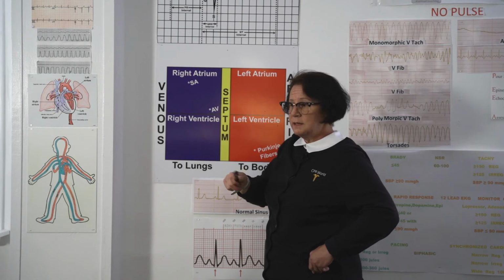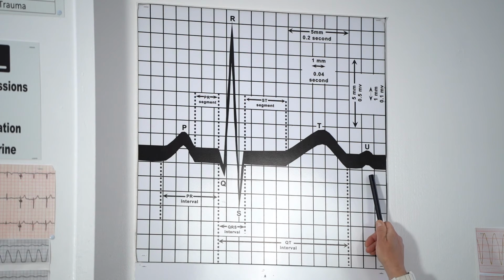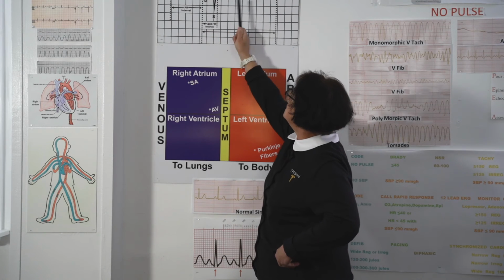It's just an indication, but you'll only see them when they're bradycardic with heart rates less than 50, and the slower the heart rate, the larger the U wave becomes. So you won't see this in all your patients. In almost all your patients, you're going to see the P, QRS, and the T.